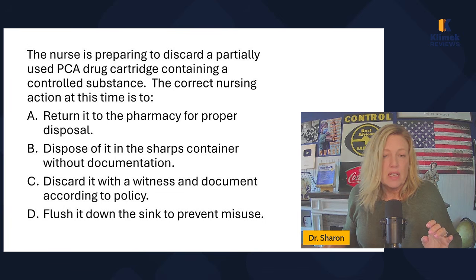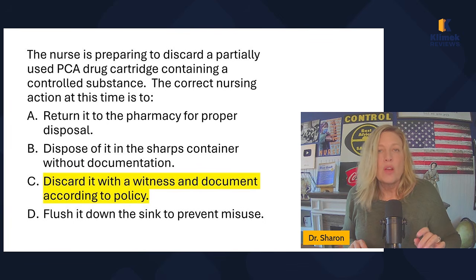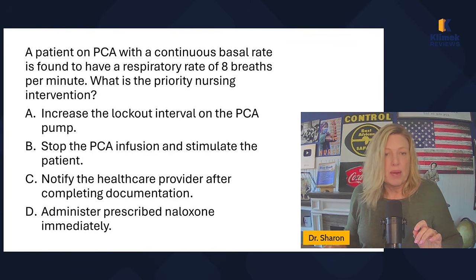Flush it down the sink to prevent misuse. No, that's not how we do it. We have to discard it with a witness and document it according to policy.